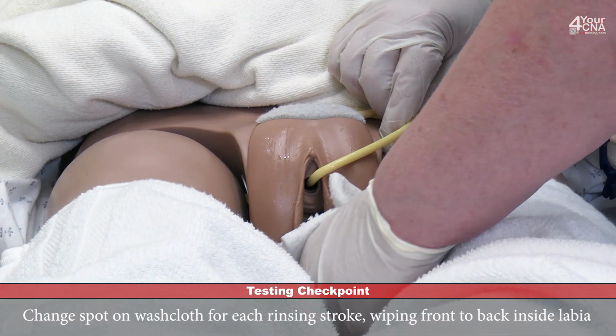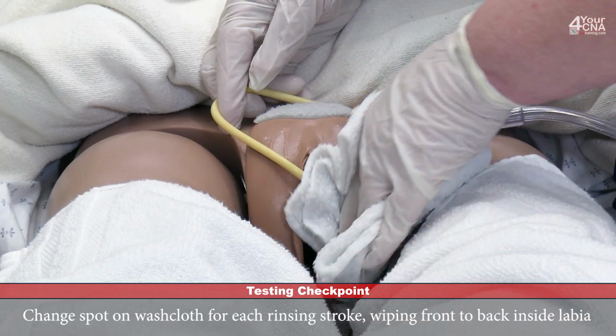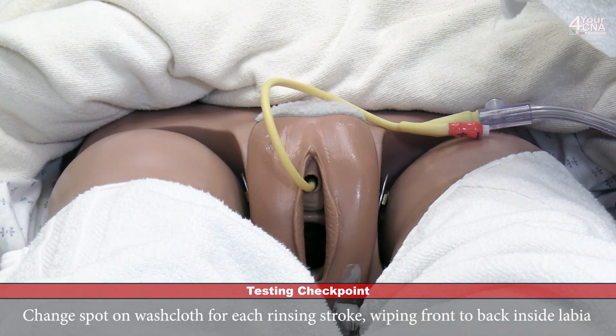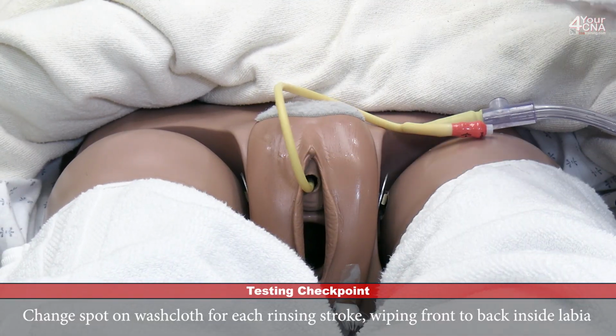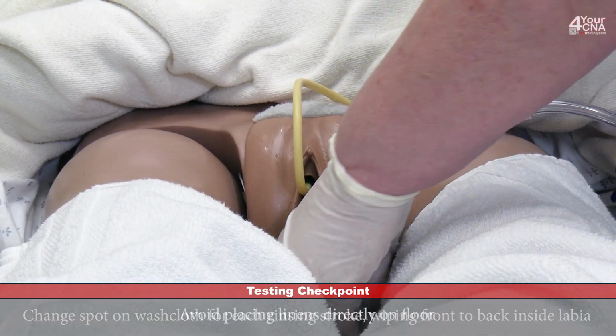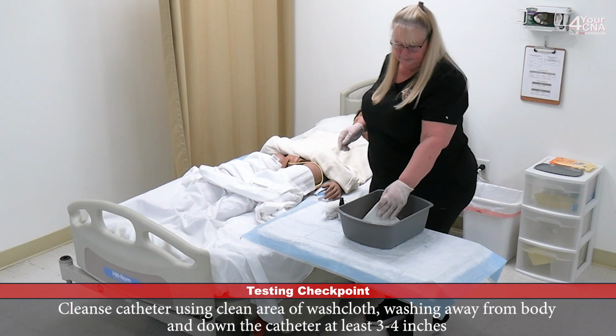We'll rinse the outside of the labia, top to bottom, fold that over. The other outside of the labia, top to bottom, fold that over. This is going to rinse the skin fold. Fold that over, rinse the skin fold. We'll set that aside. Now we're going to clean the tubing.